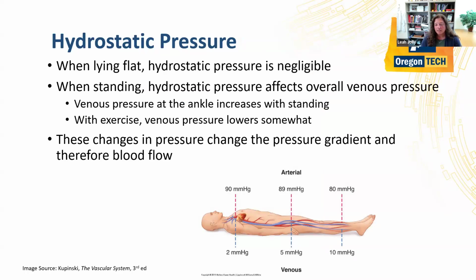So we can use patient positioning to our advantage sometimes to make the veins look bigger and to help us see them better or to test for different things. So we'll talk about patient positioning for that tomorrow in the venous webinar.